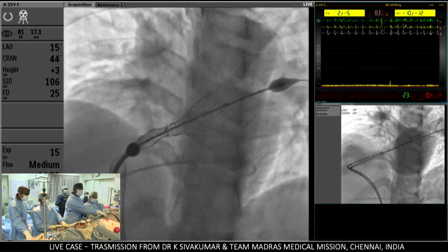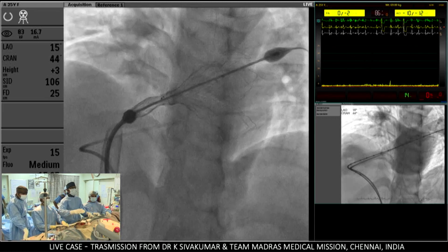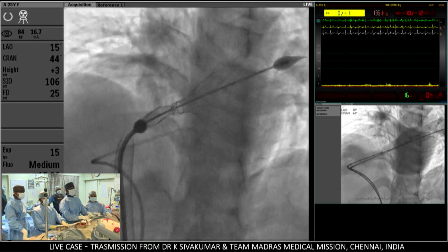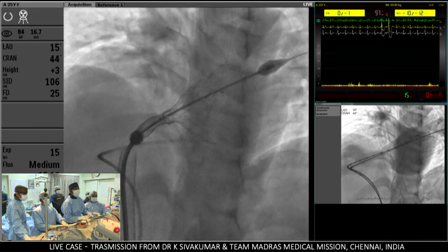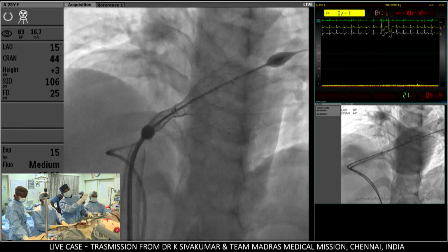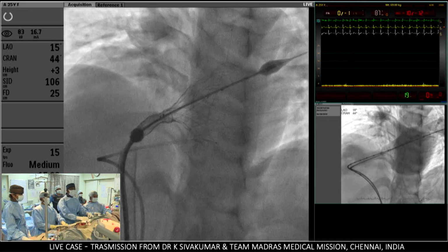Okay. Now, get ready. Another injection. Go a little up. Ready? Just a quick question. While you're doing the angios, do you wait for the valve to warm up so it expands to its full size? Yeah, it's expanding, Salim. It's becoming larger. Yeah, a couple of rotations, still you come to the platinum marker. That's enough, Shiva. I think we can come back more. Okay. Let me make another angiogram.